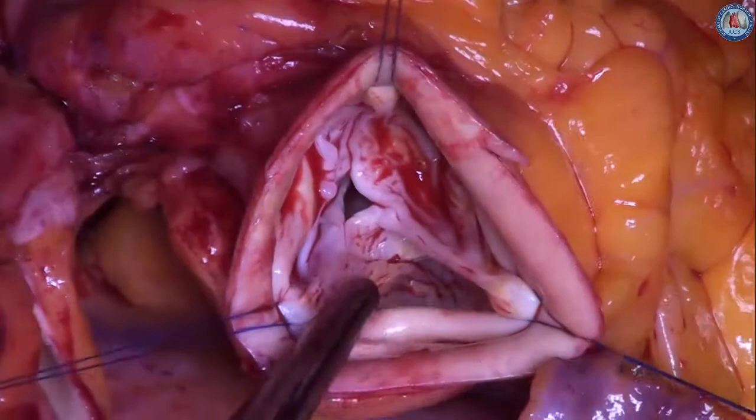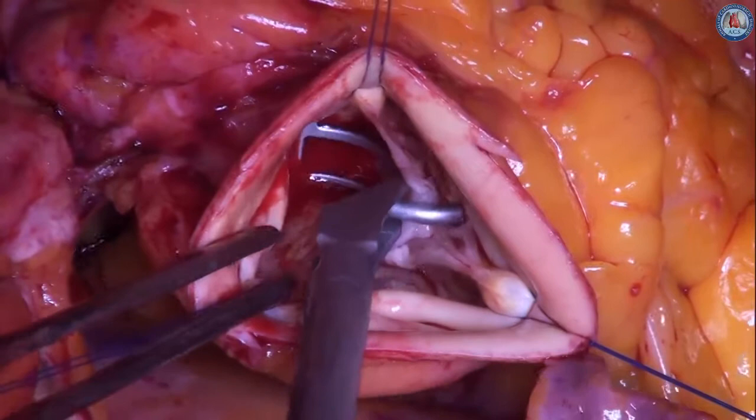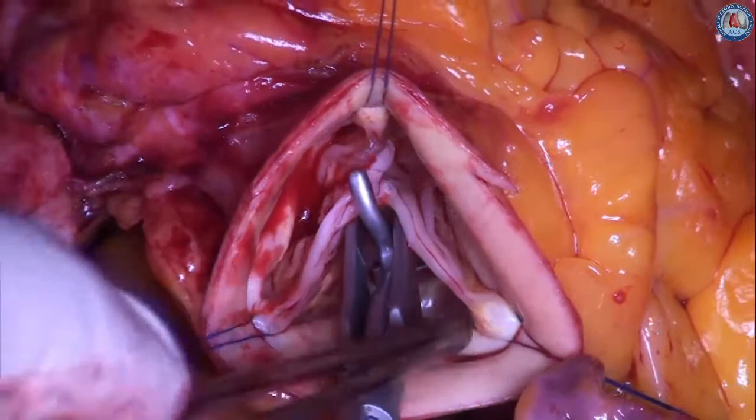The diameter of the basal ring is determined by direct intubation with graded Hegar dilators. Cusp prolapse is defined as an effective height of less than 9 mm, and it is measured using a special caliper.